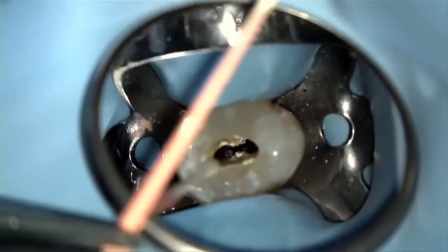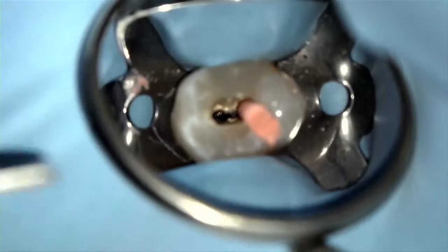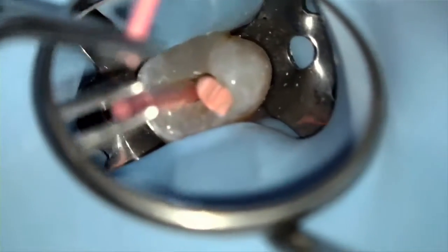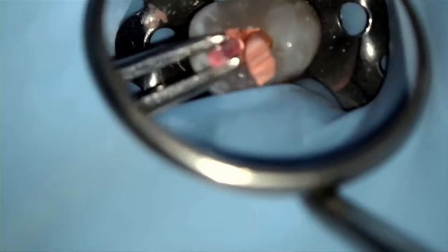As shown in the video, in ovoid or large canals, I personally like to place a single master gutta-percha point corresponding to your master file at one side of the canal, and in turn leaving space for the GuttaCore that will be inserted alongside of it. To improve visibility and reduce interference with the warm GuttaCore that will be inserted, I suggest cutting the cold gutta-percha at or below the occlusal table. This is the same as what I recommended doing with the paper points meant to block out adjacent canals.